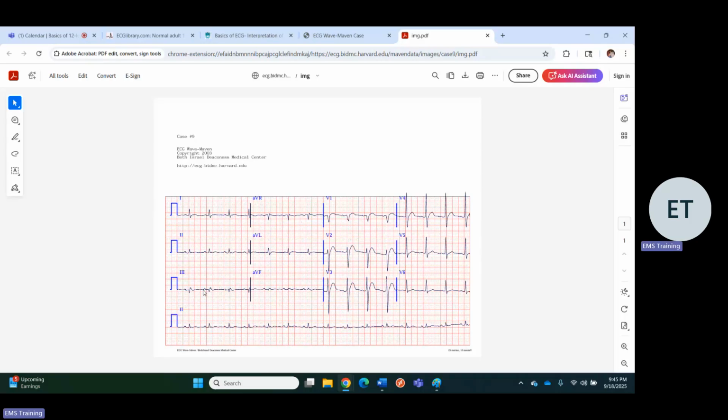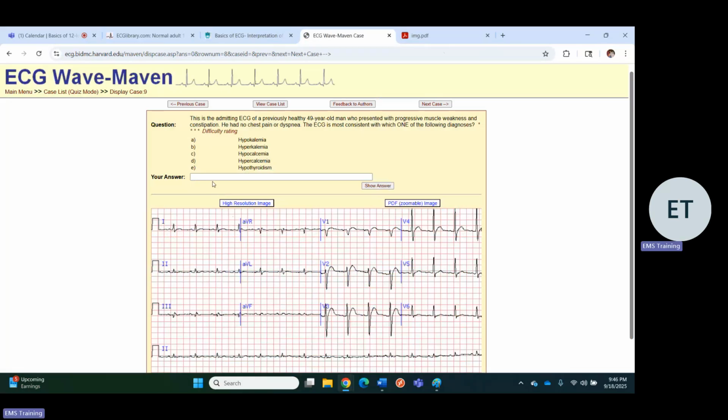There are significant Q waves in lead 3, to a lesser extent AVF. I don't think that this is ST elevation. But the complex is so small that it could be a disproportionate size. But in the presence of a right bundle branch, left bundle branch block, you would need to apply Sgarbossa. And because it's so small, I don't know. This could be an MI. But I don't know. This looks so weird. Okay. Oh boy.